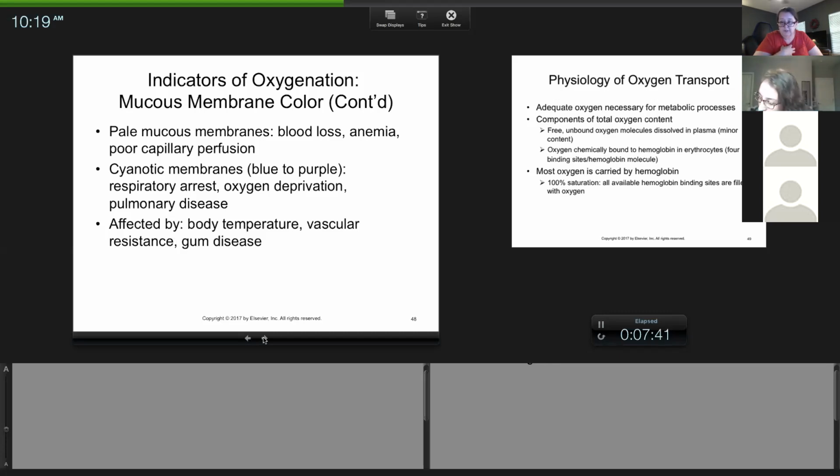So that means for some reason, the animal is not getting oxygen. Or do they have pulmonary disease? Do they have pneumonia? Pneumonia blocks oxygen from being diffused in the alveoli. So they are inhaling. I do a chart. We're going to be doing a pulse oximeter troubleshooting thing, and it's basically, where's the problem? Is my dog not getting oxygen? Is he getting oxygen and it's a mechanical issue, or is he not able to use the oxygen? If it's a dog with pneumonia, it's not that he can't access oxygen, he can't use it. So that's how the mind has to work.